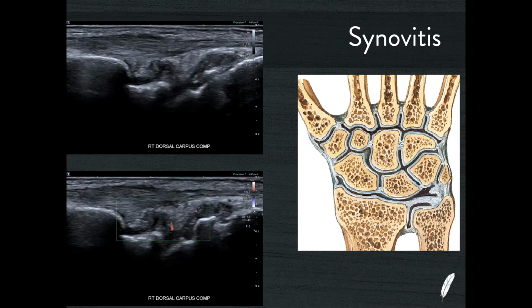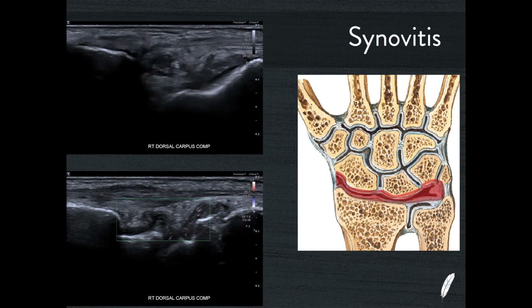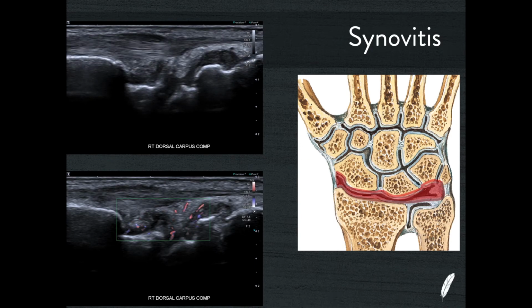The next thing I want to move to is the wrist, and I want to talk about another forgotten joint. So if the posterior subtalar joint is a forgotten joint, I also think the distal radioulnar joint is. The first joint I assess in the wrist is the radiocarpal joint. It sits between the radius and the scaphoid, lunate and triquetrum.